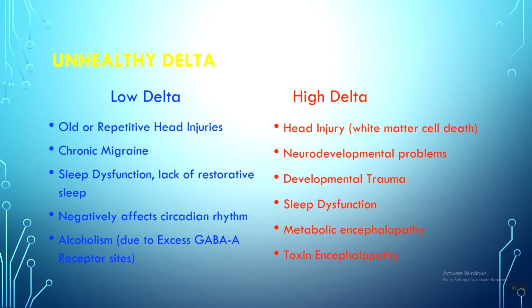And so young ones adapt. And if what you have in your toolbox is delta as a baby, and you're in a dangerous environment, that's the thing that's going to get enhanced. So you may just see it in an adult's EEG, and it might not be a TBI. It might be something that's earlier, right? Something that's from early life.